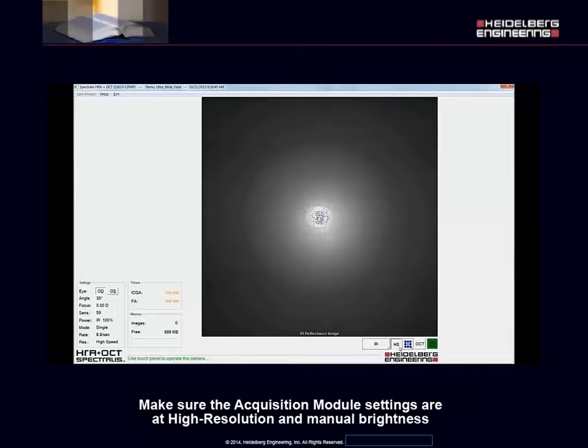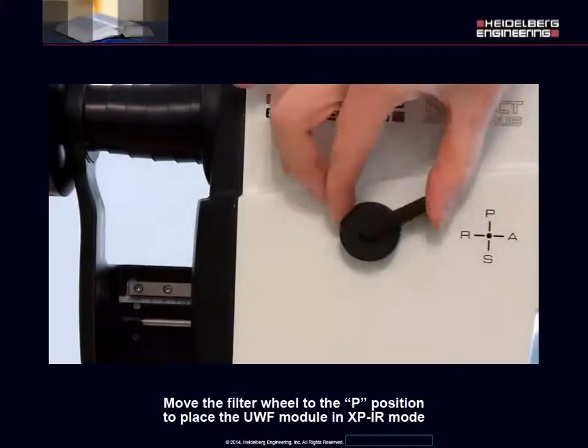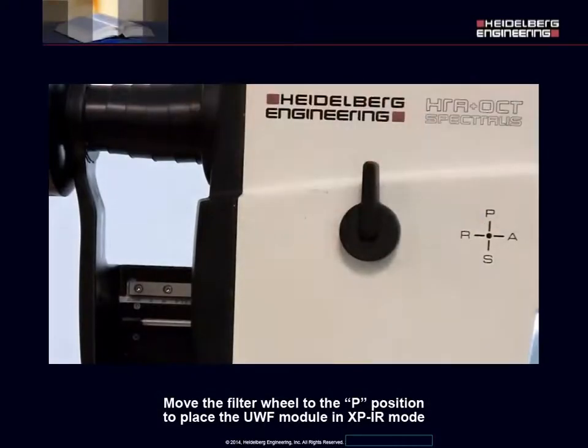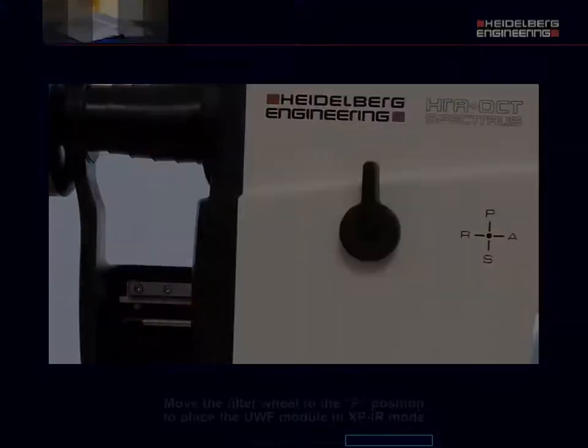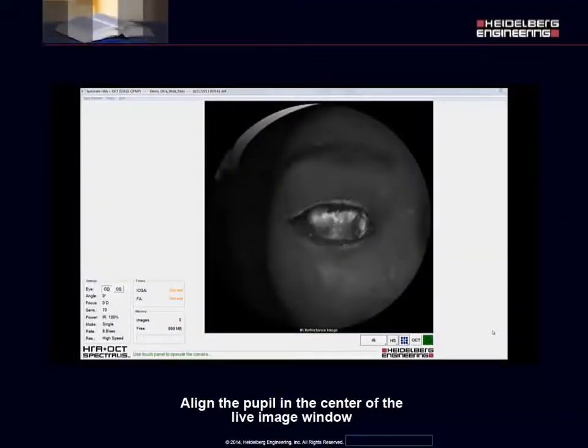Make sure the acquisition module settings are at high resolution and manual brightness. Move the filter wheel to the P position to place the ultra-wide field module in XPIR mode. Align the pupil in the center of the live image window.